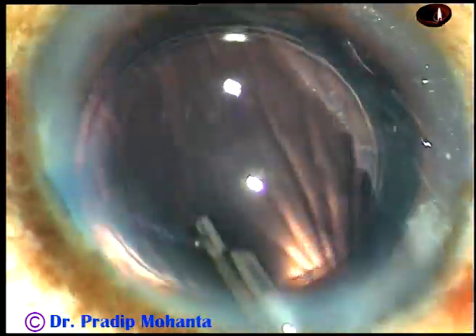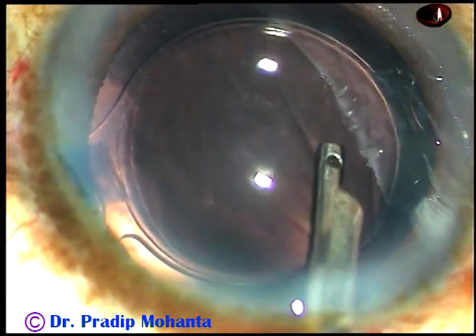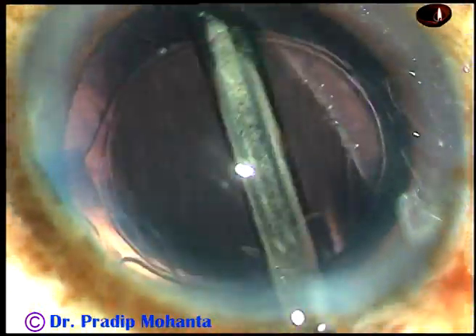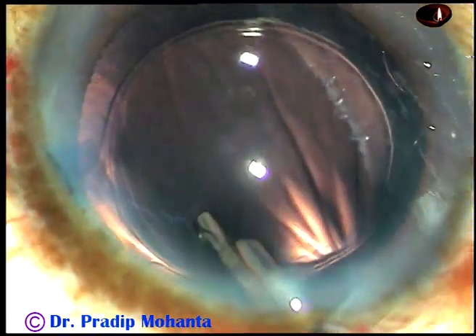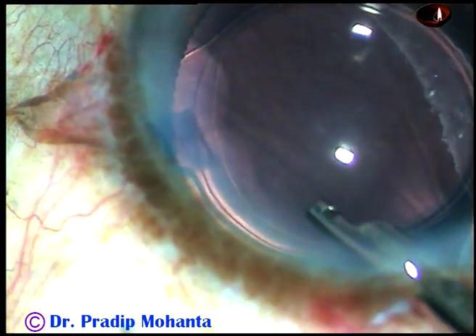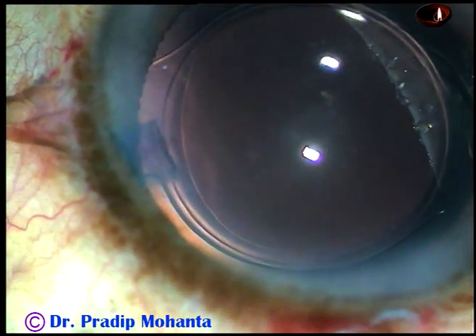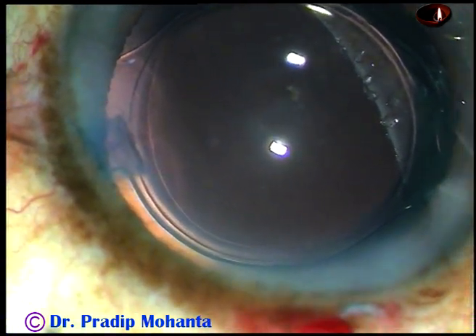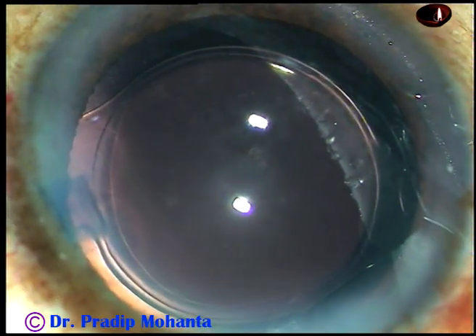Then the anterior chamber is formed nicely. The intraocular pressure at the conclusion of surgery should be on the higher side. The integrity of the wounds is checked, and the case is concluded.